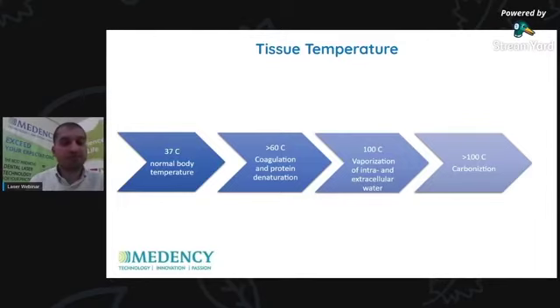Carbonization is something we all hate, and we don't recommend it in our treatment as laser dentists, but it may happen. It is not that bad, but it delays the healing, and the healing quality is less with carbonized tissue. So we have to take care not to reach carbonization. Carbonization also appears as a black color over the tissue we are working with.